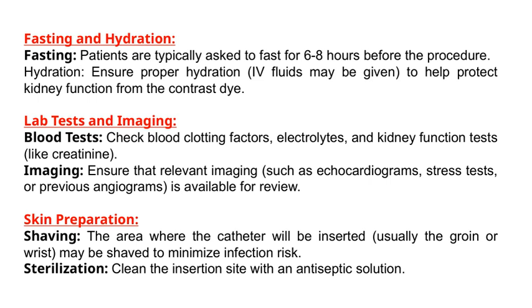Now let's discuss skin preparation. Before the procedure, the area where the catheter will be inserted, usually the groin or wrist, may need to be shaved. This step helps reduce the risk of infection. After shaving, the site is cleaned thoroughly with an antiseptic solution. Proper skin prep is a key part of infection control and ensures a safe, smooth procedure. Altogether, these steps, fasting, hydration, lab tests, imaging, and skin prep, are all about making sure the procedure is as safe and effective as possible.